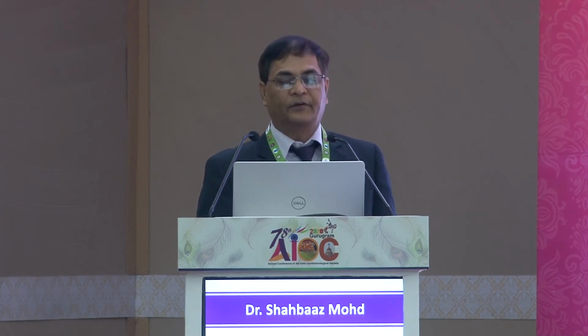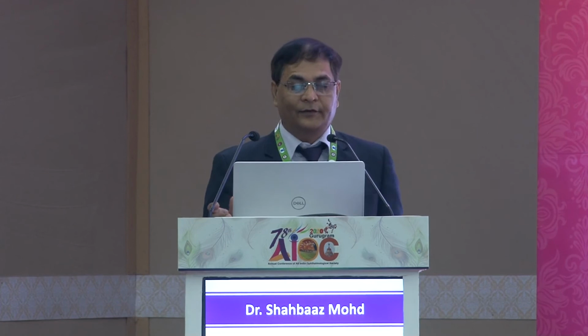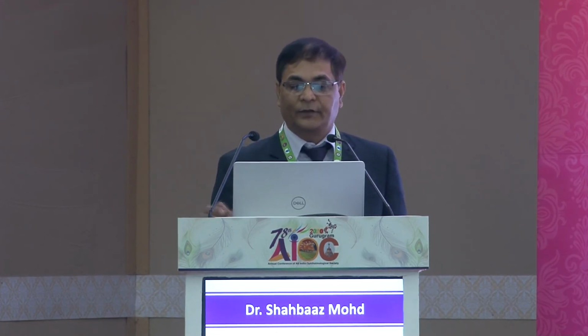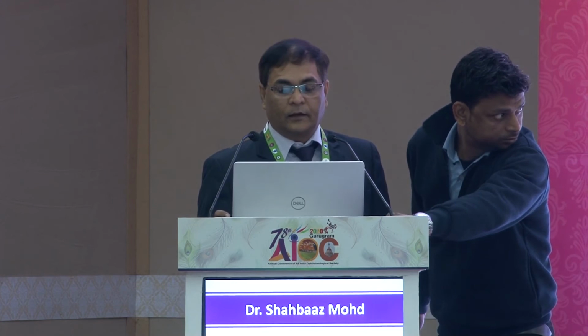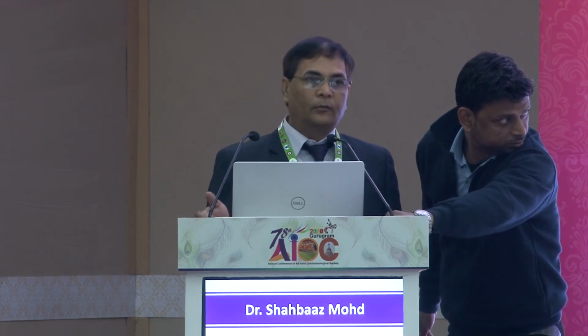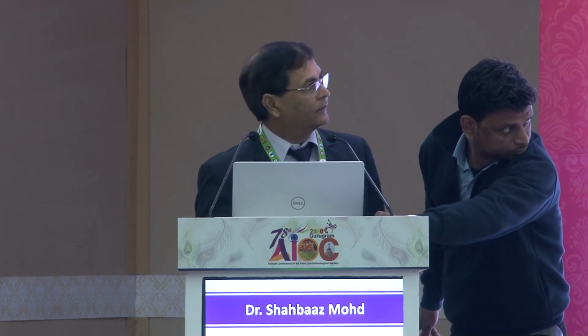So this is the difference between the contact and immersion. Here you have 2 extra spikes, from the anterior surface of the cornea and the posterior surface of the cornea. The advantage is, as we have already discussed, no applanation is required. Alignment is better and easier due to the corneal spikes, and the optimal result you get is with the immersion. It is almost comparable to your optical methods.